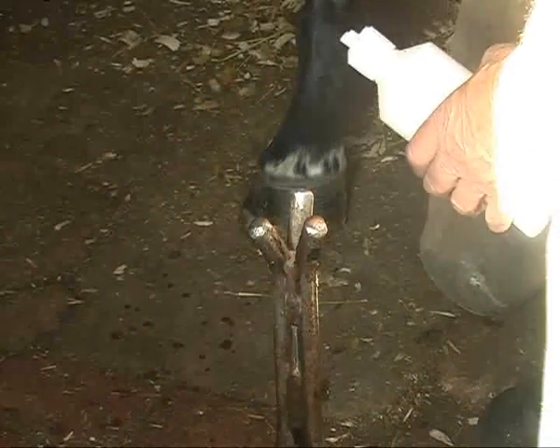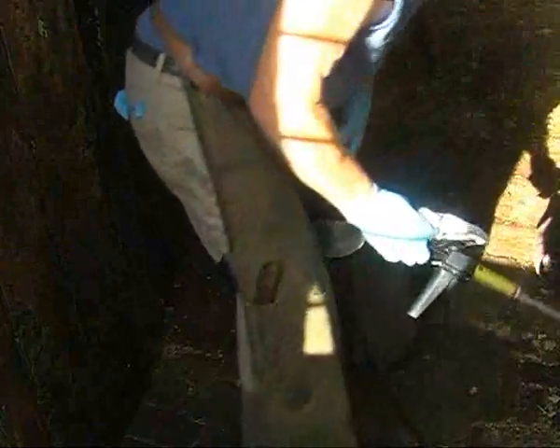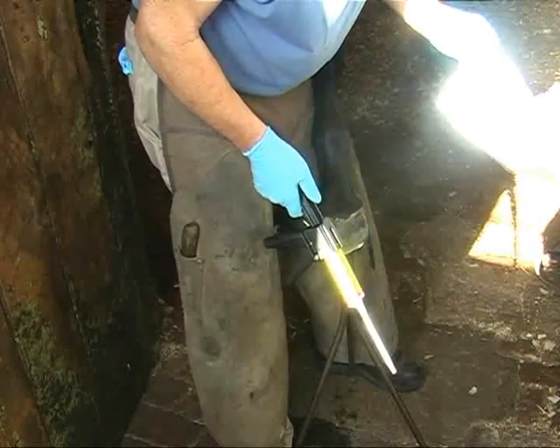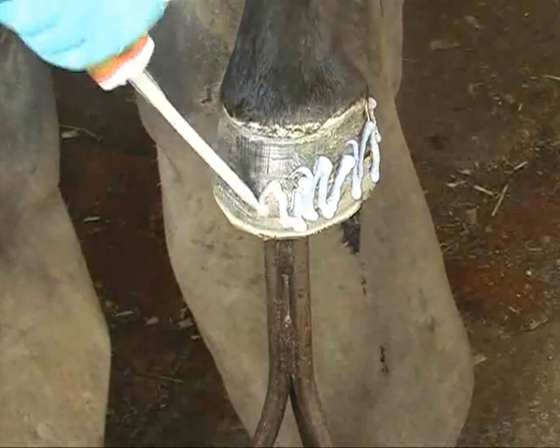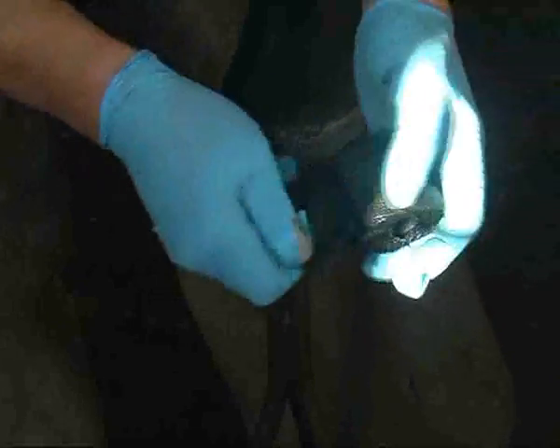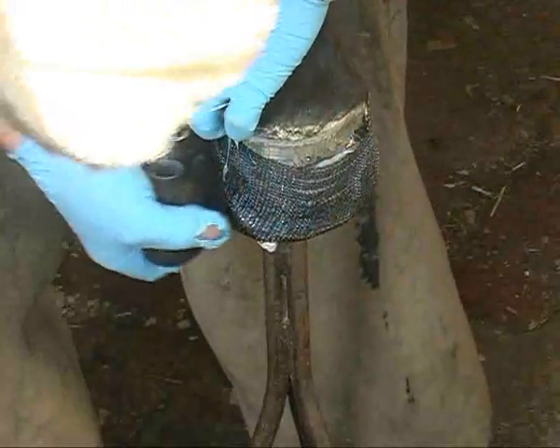The cleaner you can get it, the better. Give that a light brush — with a wire brush you'll notice that as I brush it, the heat and friction dries the foot out almost instantly. The products we're going to use today are the Equitec cuff cement and the 2-inch Equitec polyester bandage. When we put this on, we spin it around the hoof a little bit until we get that first layer on there — it spreads the glue.